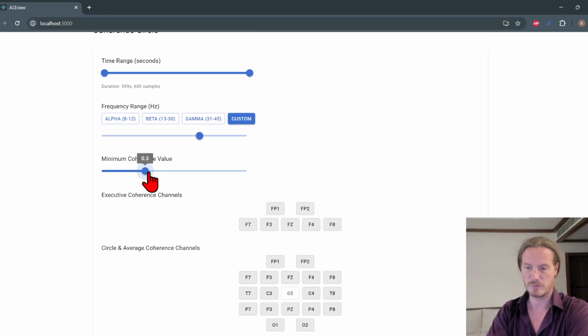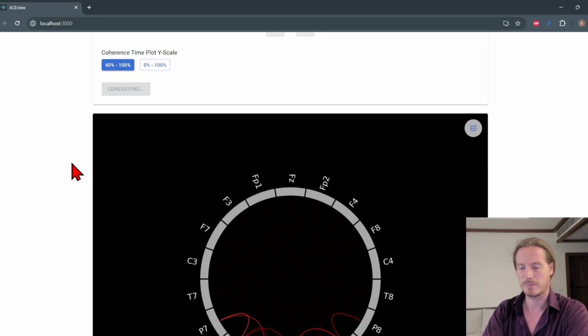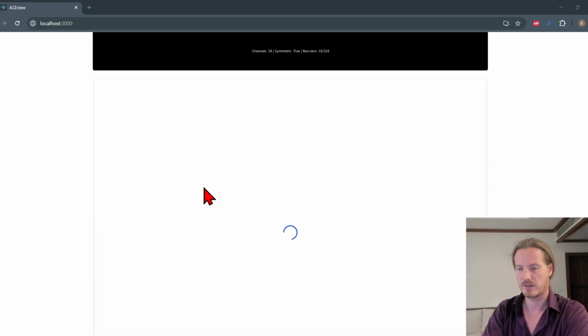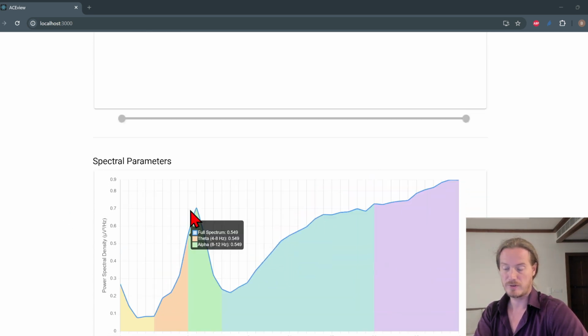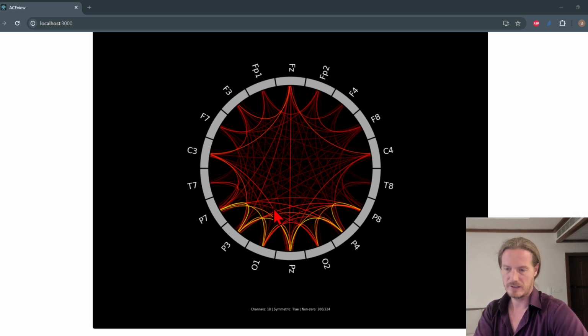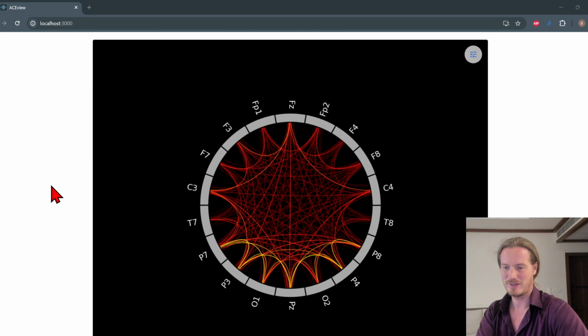So now if I lower the threshold of what we show to 0.3, to 30%, then as it's generating, oh, we've got to generate the plot. And it's generating right now. Then we can see their coherence with those settings. Oh, it is still loading the charts below, and the charts below have another feature that I haven't shown yet, which is very interesting actually. And there's also this chart, which I will talk about in a moment. There we go. Now we have the chart, what it looks like when we have the 30% coherence and up with all of the channels.